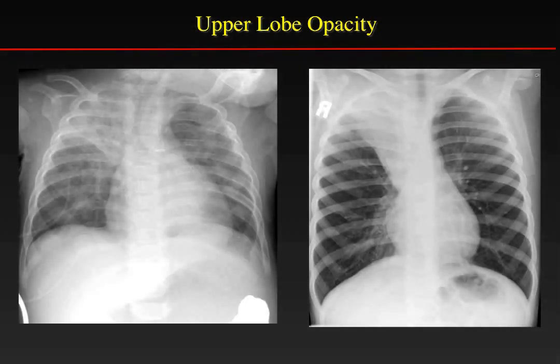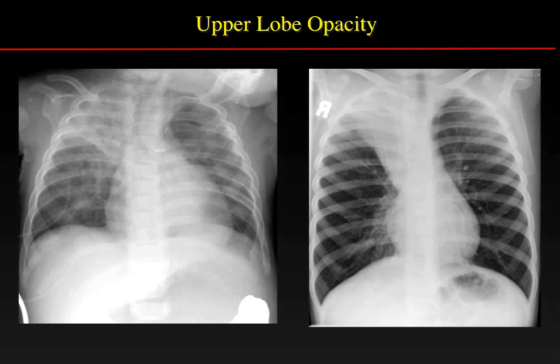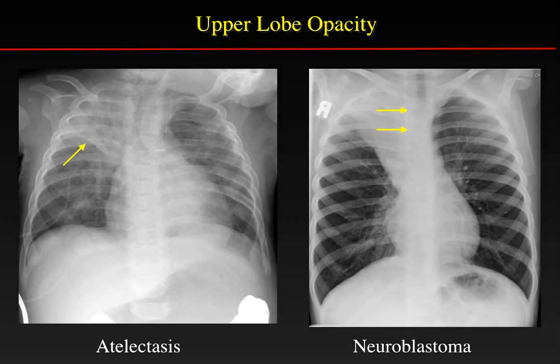Here are two more children with right upper lobe opacity. In the third child, the minor fissure is elevated with loss of volume and patchy atelectasis of the right upper lobe, and the trachea is shifted toward the abnormality — consistent with atelectasis. The fourth child has a very dense lesion in the right upper lobe with no associated atelectasis, we cannot see through the lung, and the trachea is being displaced away from the mass. This is a child with neuroblastoma.